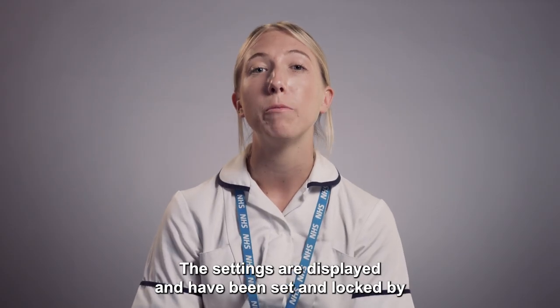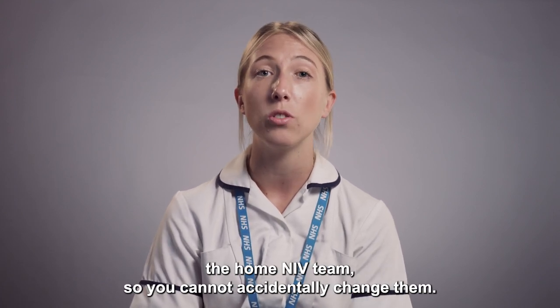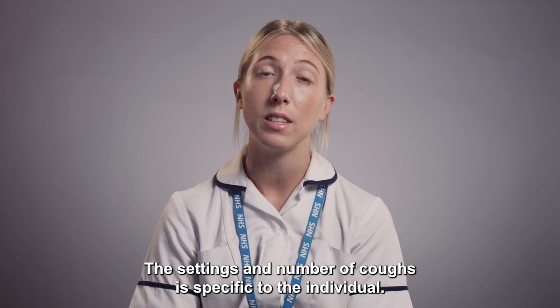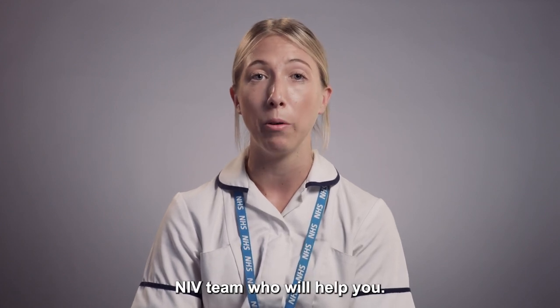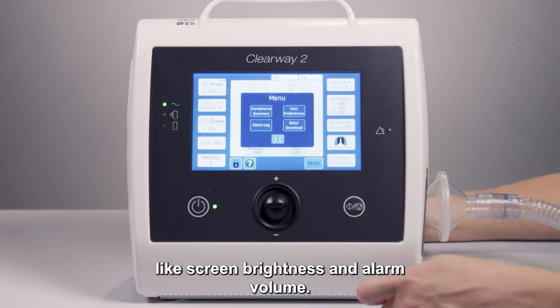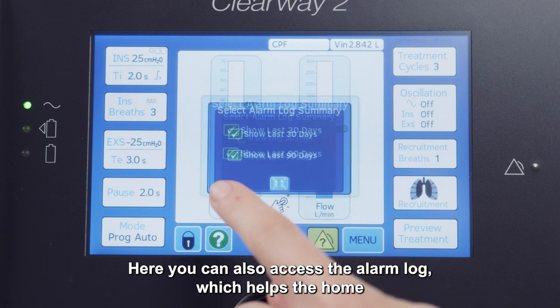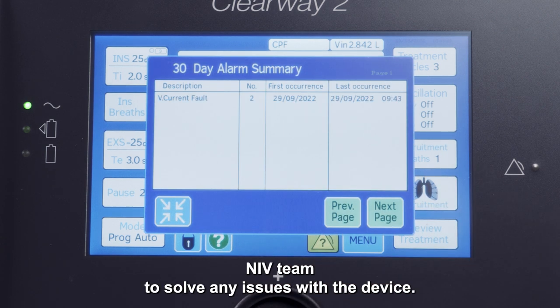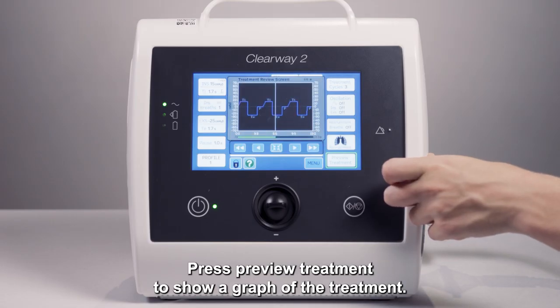The settings are displayed and have been set and locked by the Home and IV Team, so you cannot accidentally change them. The settings and number of coughs are specific to the individual. If you are unsure, please contact the Home and IV Team who will help you. You can access the menu to adjust things like screen brightness and alarm volume. Here you can also access the alarm log, which helps the Home and IV Team to solve any issues with the device. Press Preview Treatment to show a graph of the treatment.